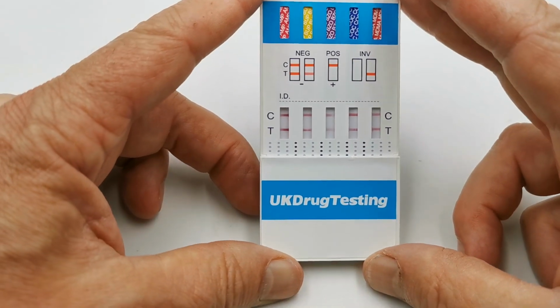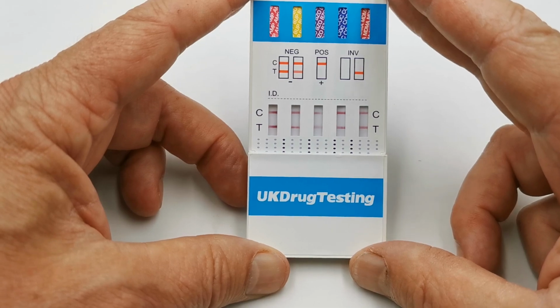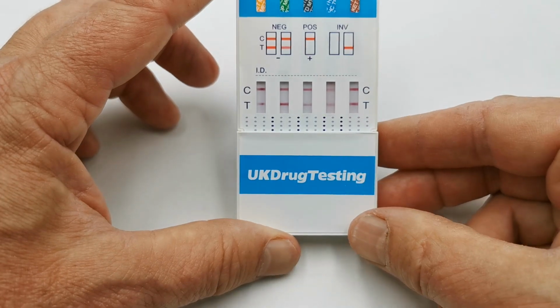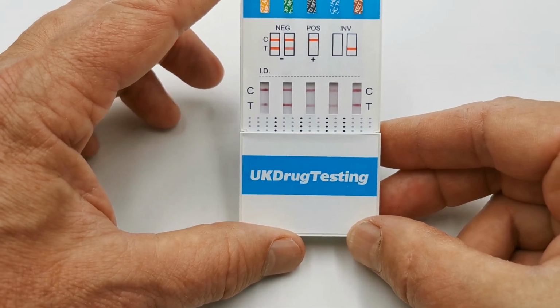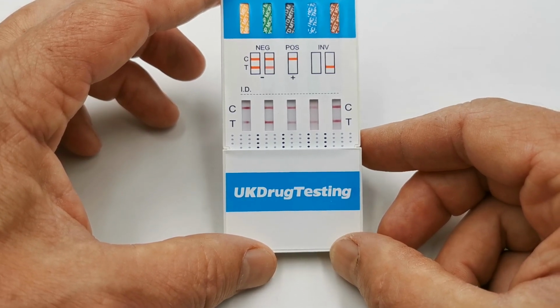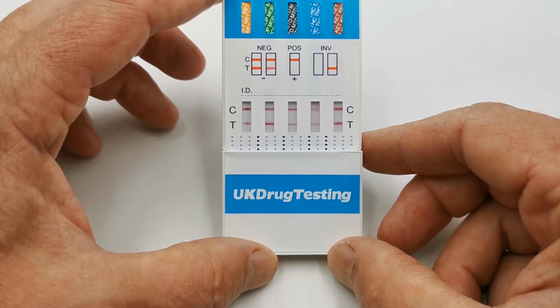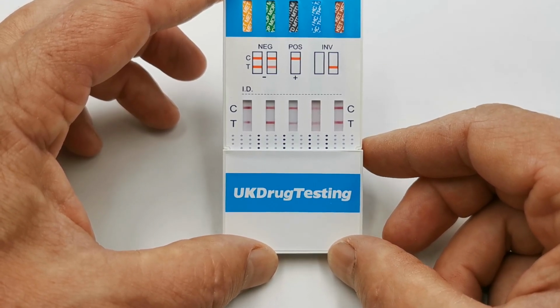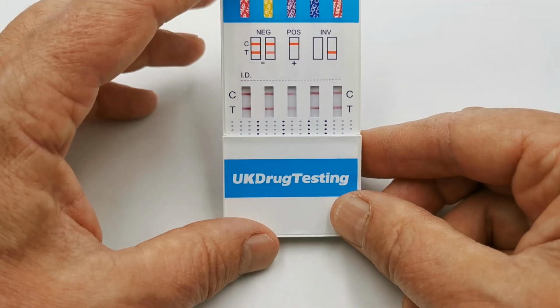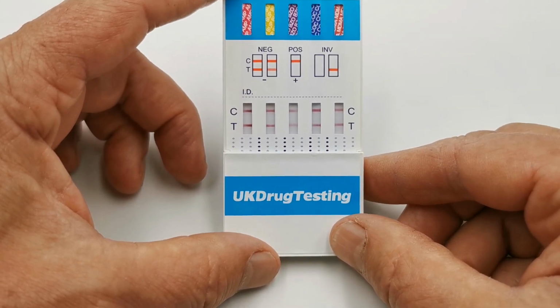Nice clear white background, the pink dye is almost completely cleared, and you can see what we're looking for on this side of the test is 5 control lines, which we've got. Reverse the test and check the back, we've got 5 control lines showing again on the rear. Now we're then looking for the interpretation of a positive or negative result by the absence or presence of a test line with a control line in the read time of 5 minutes. And you can see we've got test lines across all 5 of these membranes on one side and a matching 5 test lines on all 5 membranes on the rear. So this is a completely negative test result.